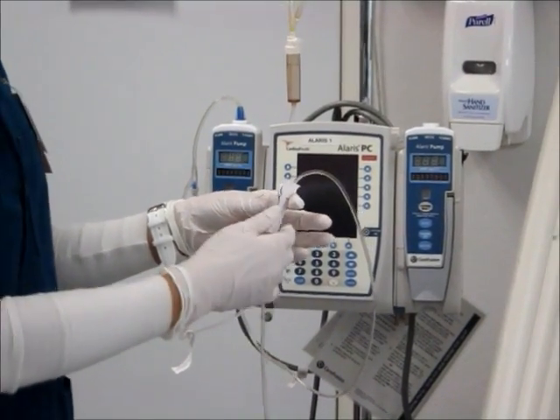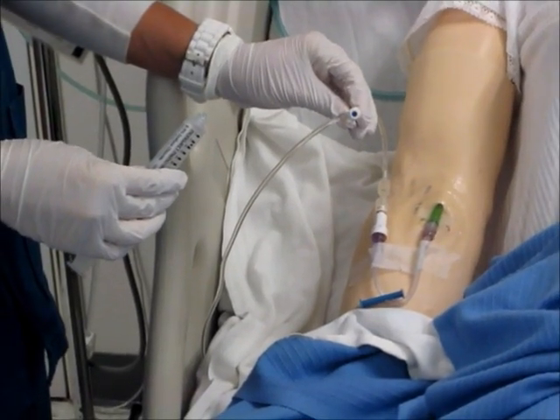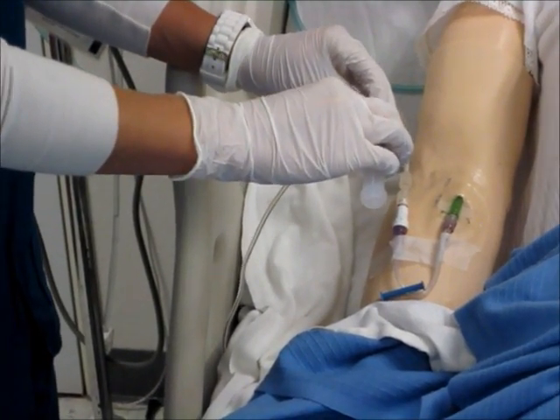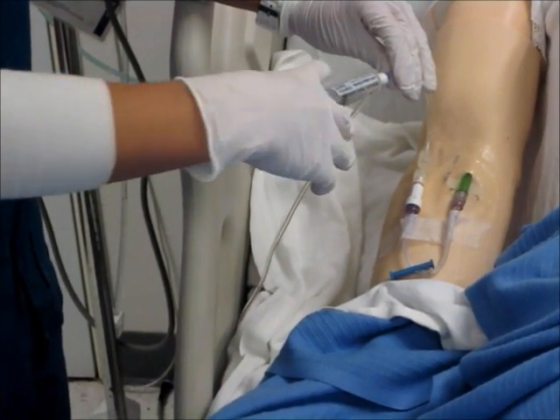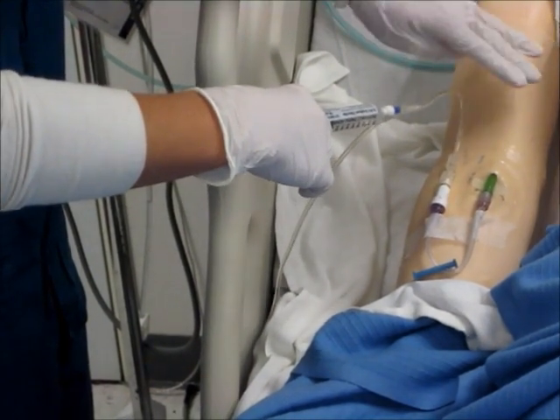For a running IV infusion, the nurse will clamp off the existing IV line. She will attach a 10 cc saline flush, aspirate for blood to make sure the needle is in the vein, then proceed with the saline administration. As she is gently pushing saline into the catheter, she will monitor the patient's response. Once complete, she will remove the syringe.